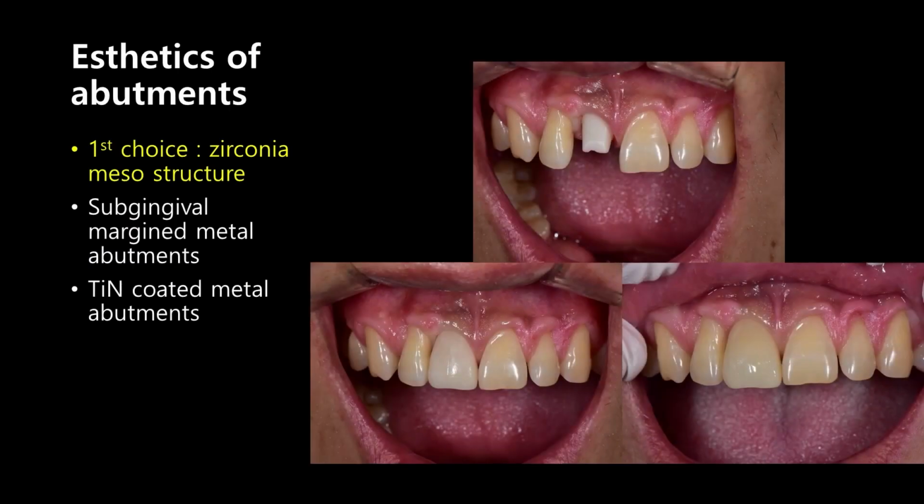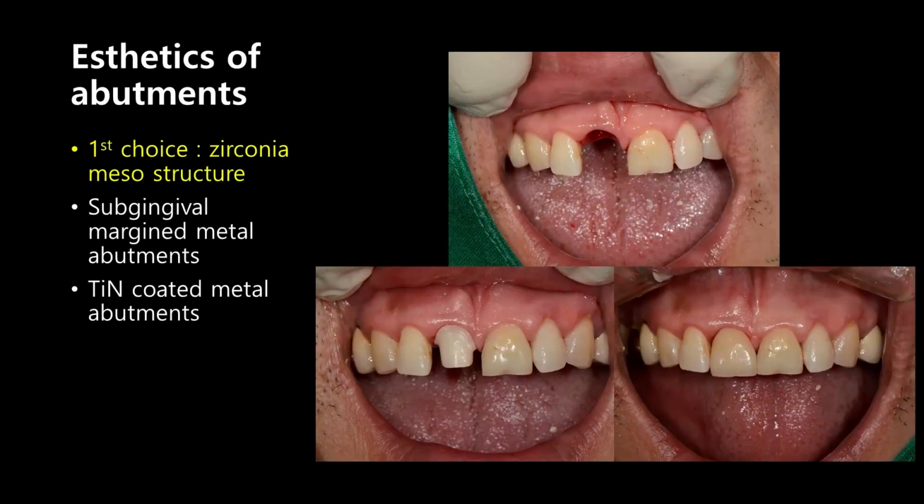Next case. Again, on top of the gingiva, a temporary abutment is used, and on the bottom side you attach the temporary, and at the right bottom it's the final crown. So the gingiva shadow looks rather natural. And in this case, also the same. Here, I did it in my early days, so abutment design-wise, it's not that elegant.